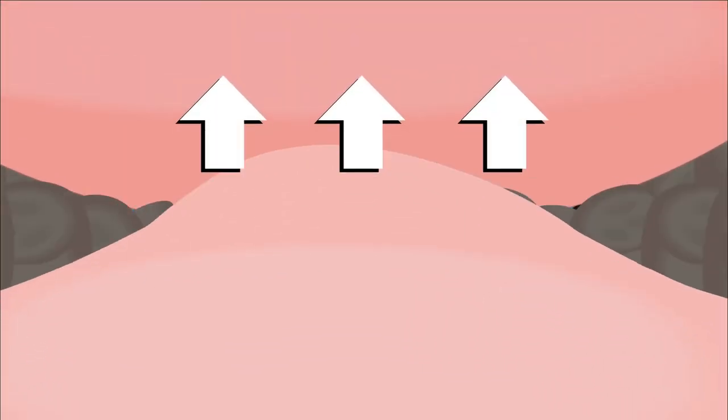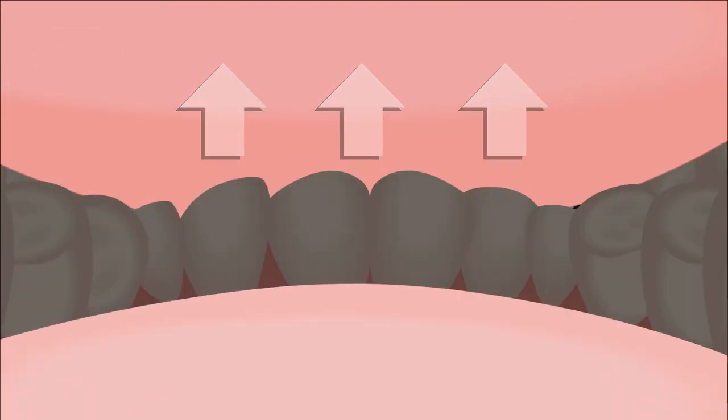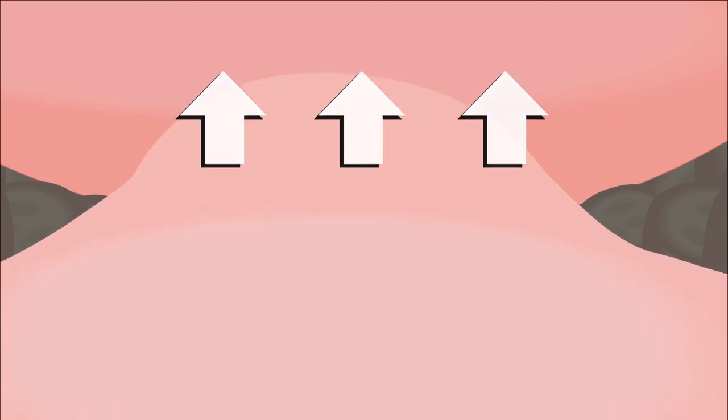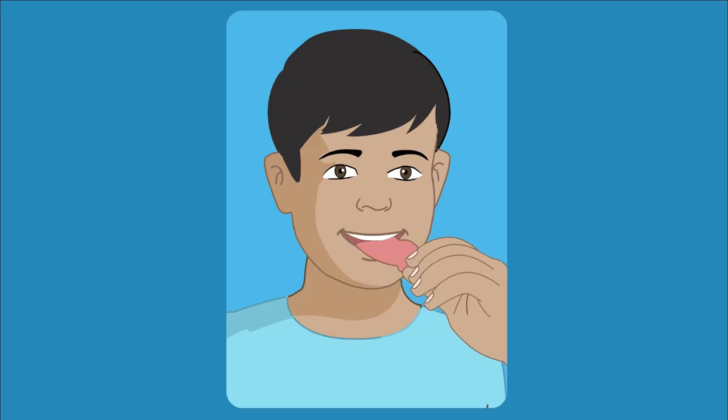Then bite down on the guard and continue to evenly press up while sucking the excess air out. Do not press too hard where the metal wires are. This may cause the guard to become too thin and split. The custom forming should take about 10 seconds.